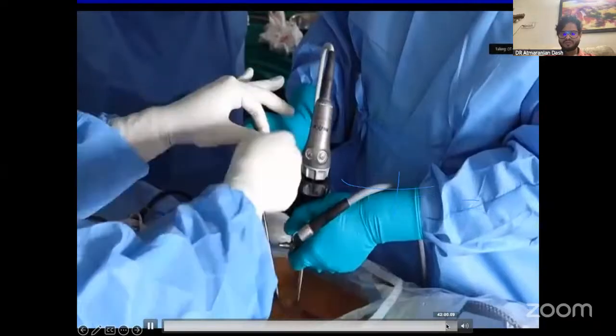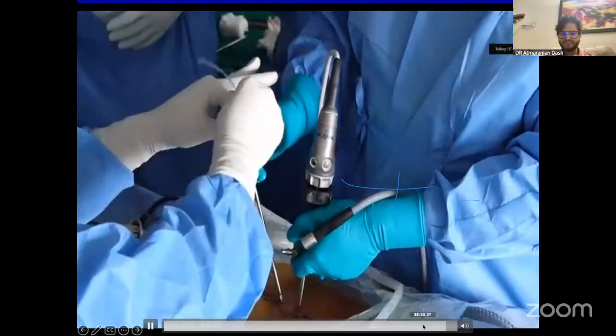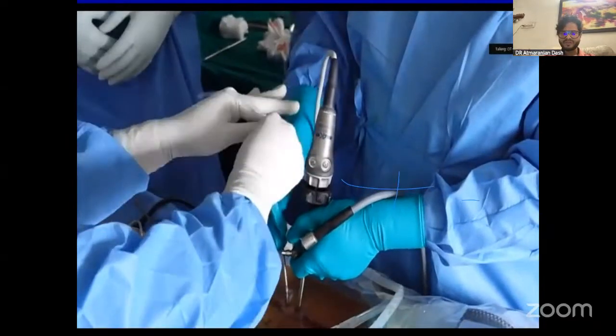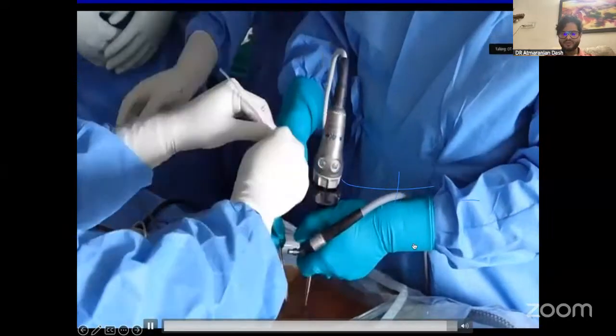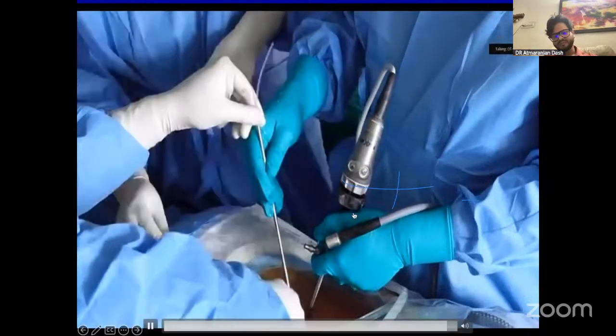So this is how we put the drain. One port is used for the drain port. Then we tunnel it through the scopy portal and remove it through the scopy portal. The same portals will be converted to a drain port.